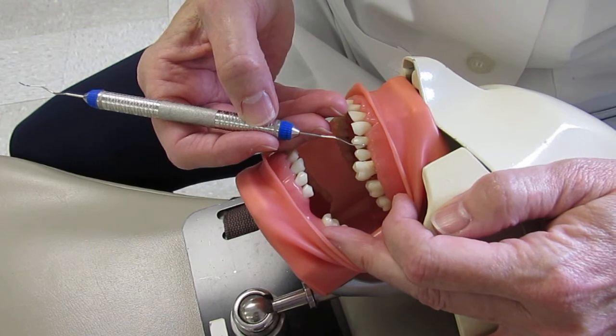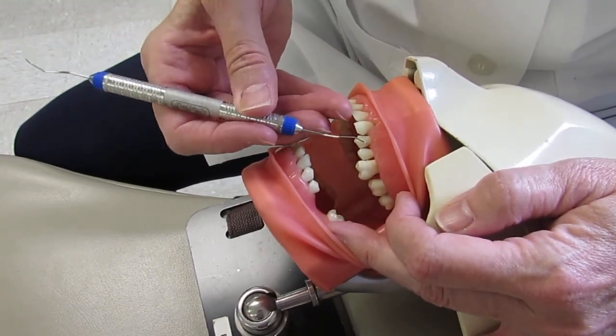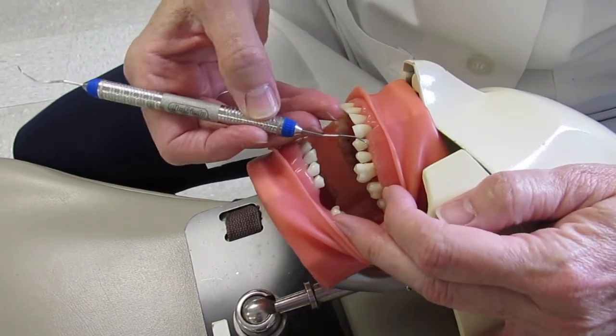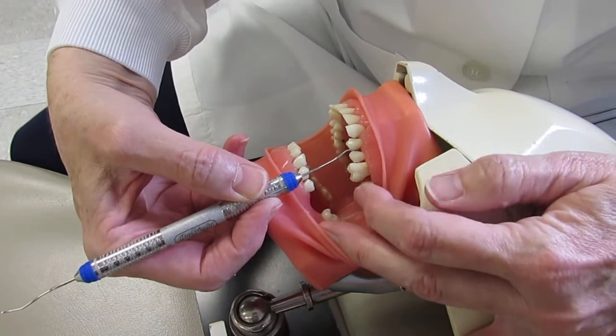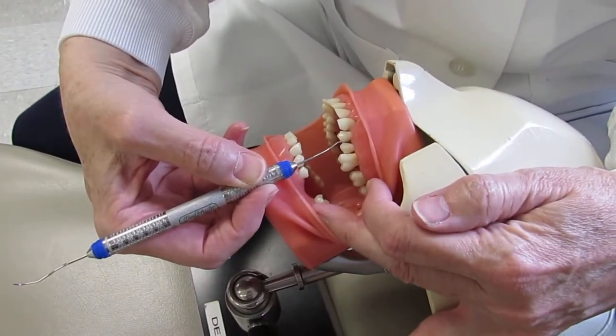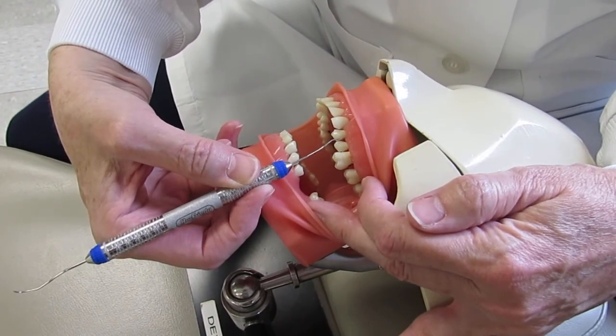To show the opposite end — the incorrect working end — notice the terminal shank is crossing that tooth. You might think you can make it parallel, but if you do, the functional shank is no longer above tooth number 12, and you could not work with the instrument in the back of a person's throat.